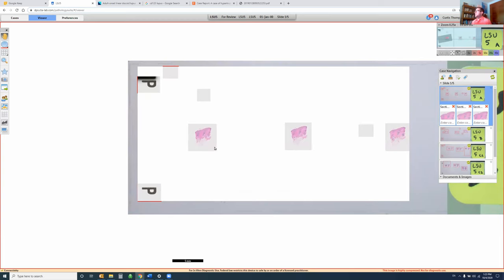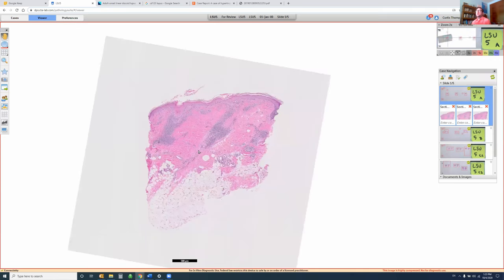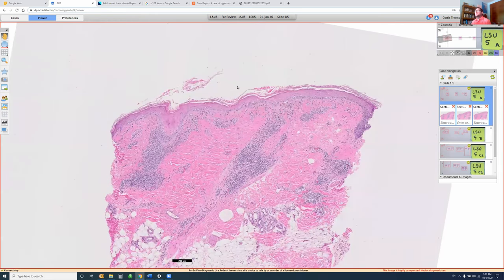The first case is LSU-5A. The clinical is a 44-year-old female with a reticulate brown patch on the left frontal scalp. You can see here there's a nice punch biopsy. We can line it up and already at this power you can see there's an inflammatory cell infiltrate. We want to describe this as superficial and deep, and we can see that the epidermis is altered.